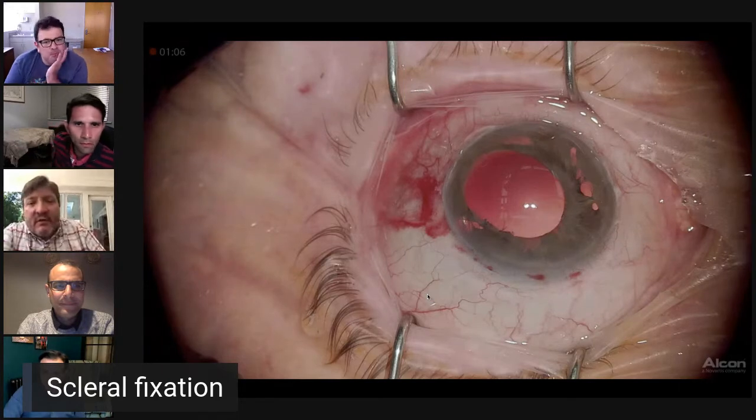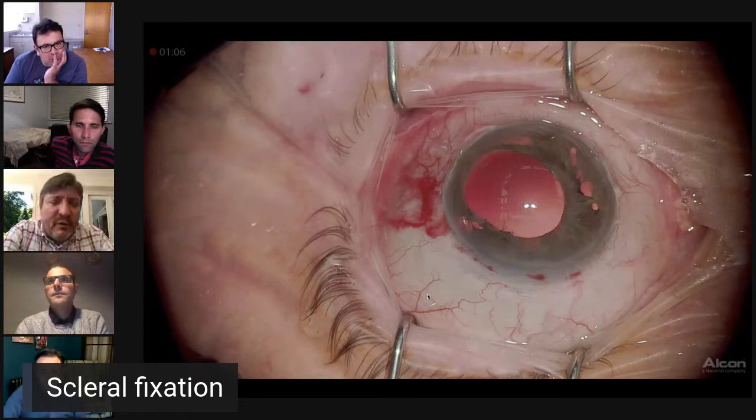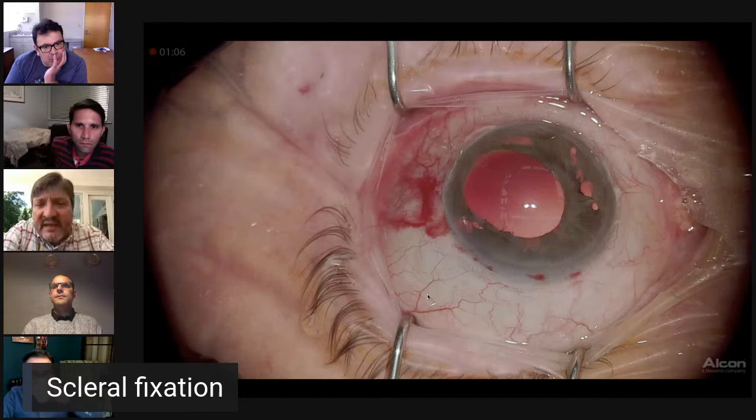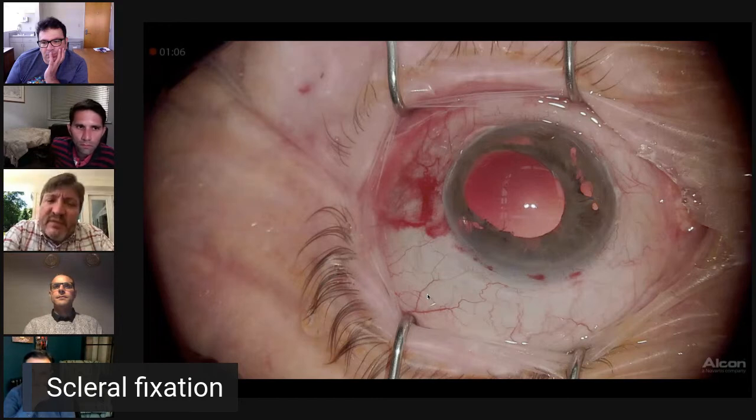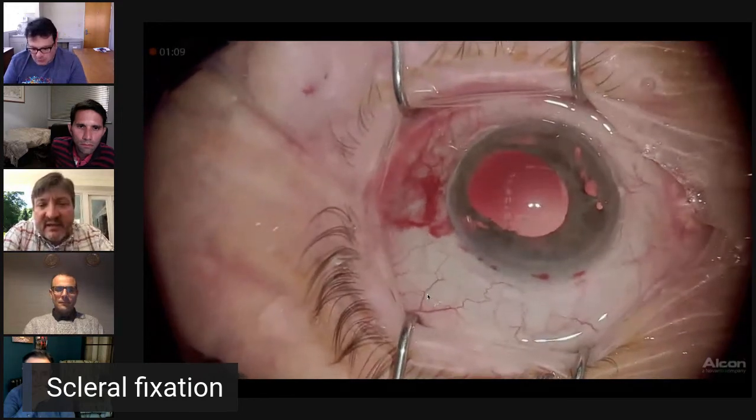Yeah. So this is an interesting case. This is a 15 millimeter white-to-white. This is an eye with megalocornea. It's had retinal detachment repair, multiple previous surgeries elsewhere, multiple iterations of IOL repositions. They ended up suturing it to his iris. That worked for several years. And then one of the iris suture prolines broke, and this lens is dangling into the vitreous cavity.